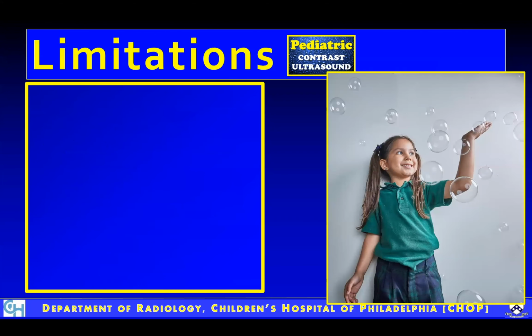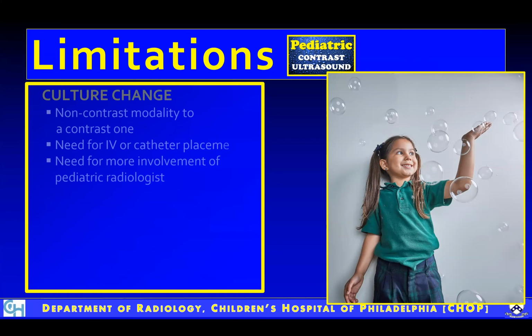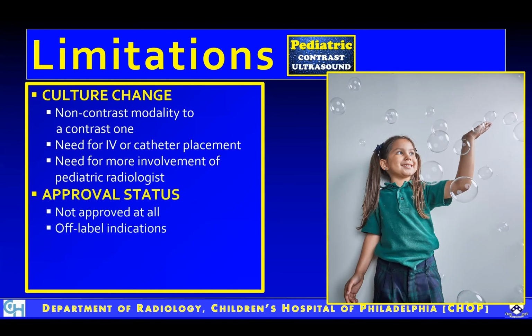So with all these advantages, you wonder what are the limitations? And primarily their limitations are ancillary stuff, but not really diagnostic. One is really the culture change, changing a non-contrast modality to a contrast one, the need for IV or a catheter, and the need for involvement of more of the pediatric radiologists, especially in the US settings where primarily ultrasound scans are done by sonographers.